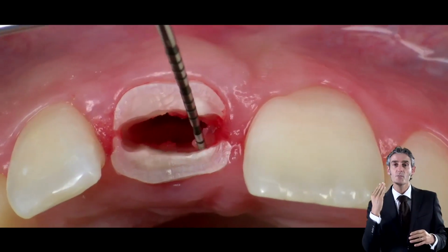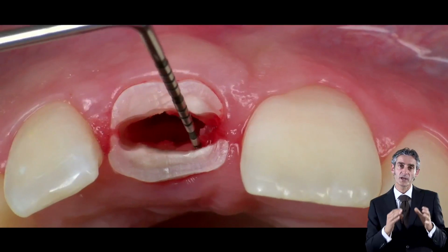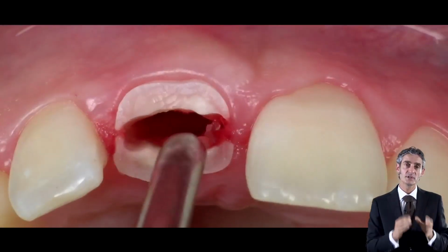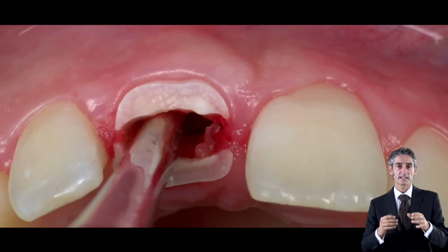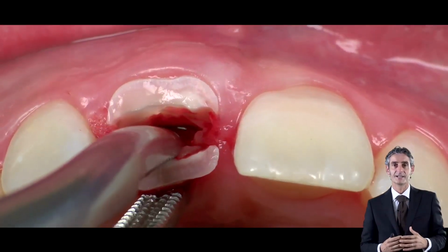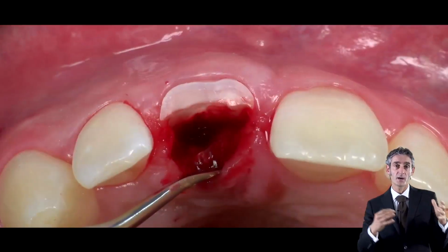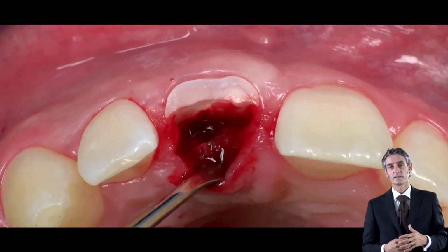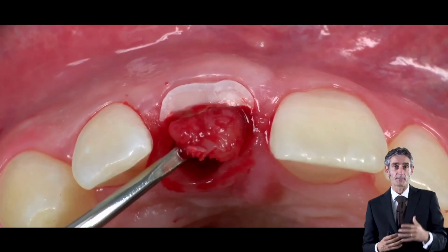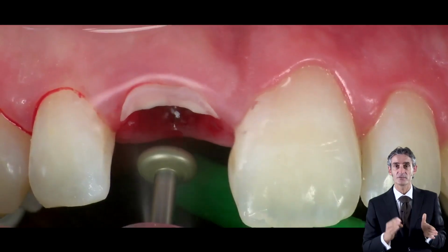Remember that we have to remove the apex. In the socket shield technique, we have to remove the apex, especially if we are in a root-treated tooth. In any case, as you can see here, you saw the invagination of the tissue inside the root. Right now, after we remove the upper part of the root, we also remove the apex. After we remove everything, we start to decrease the height of the shield in the front.